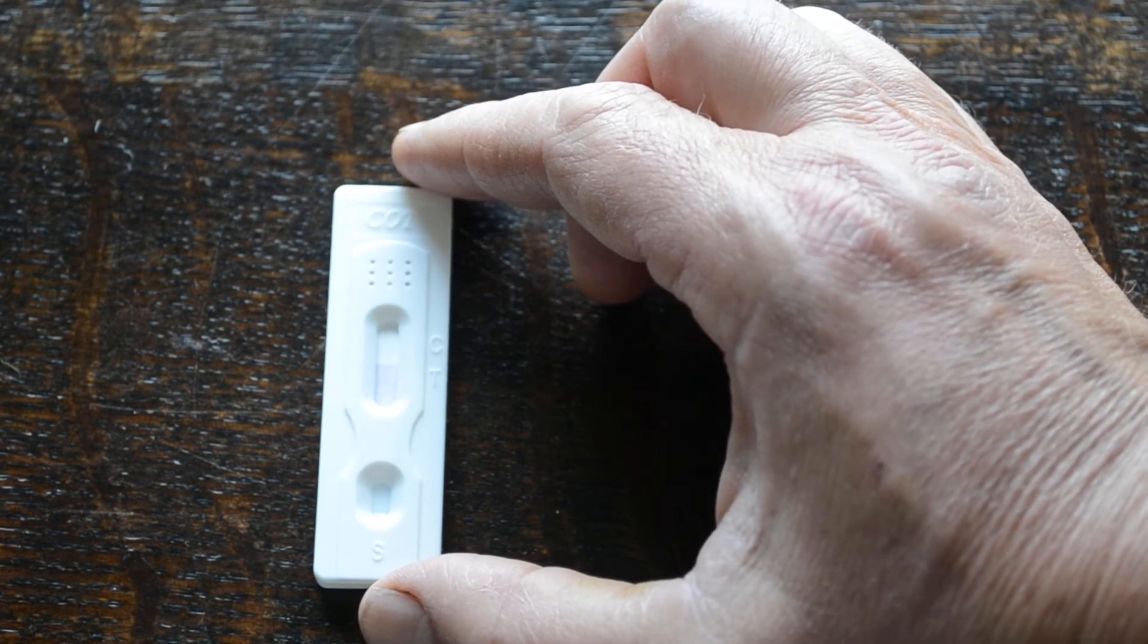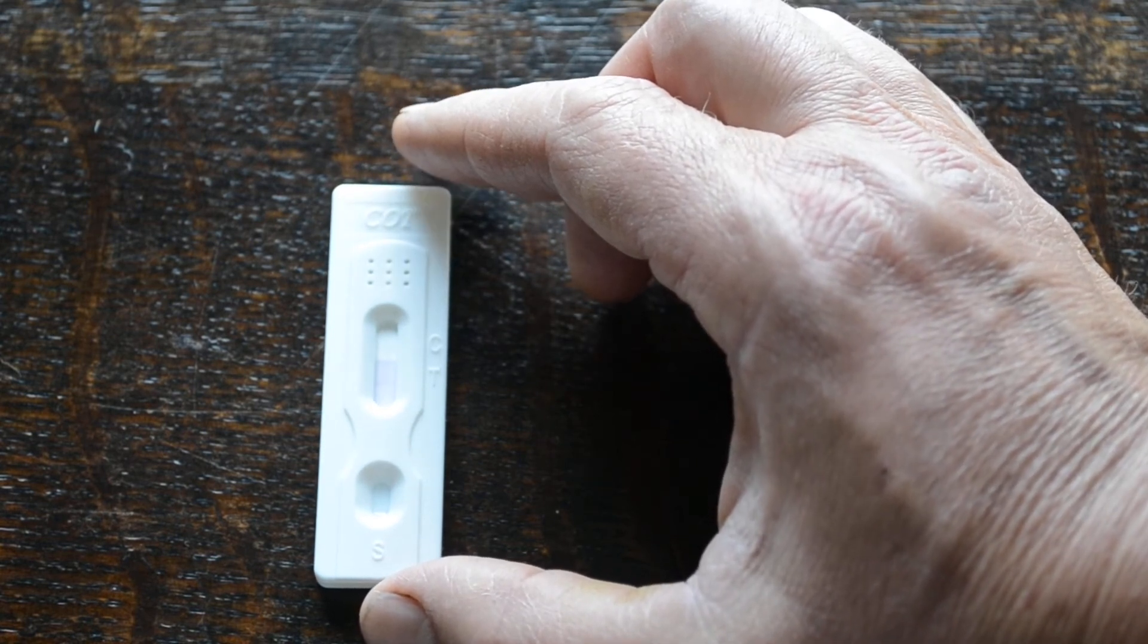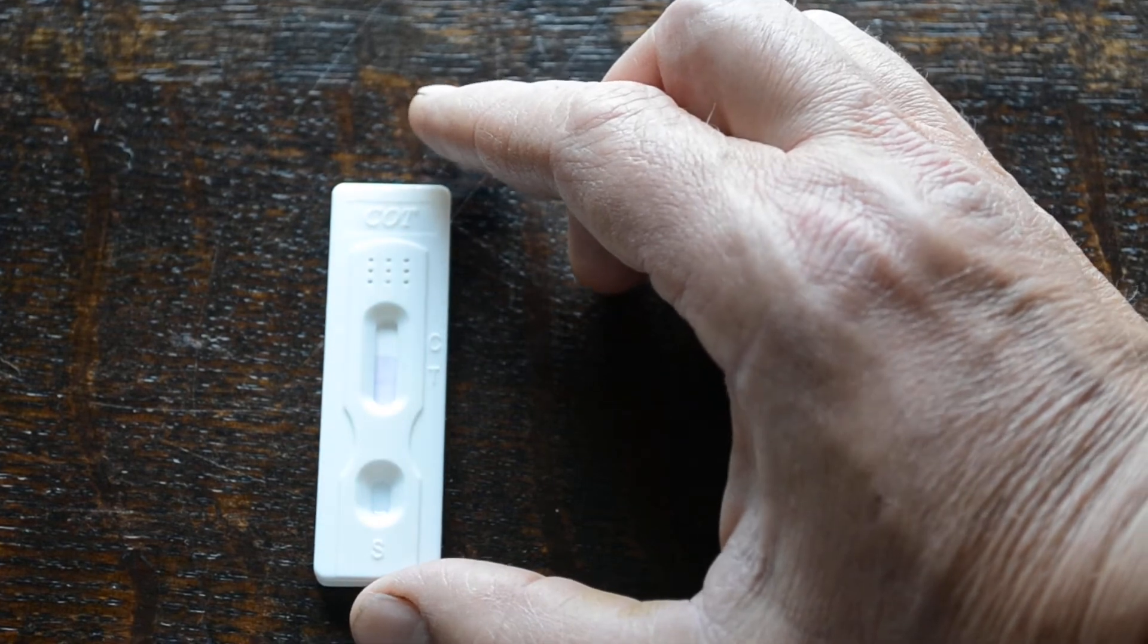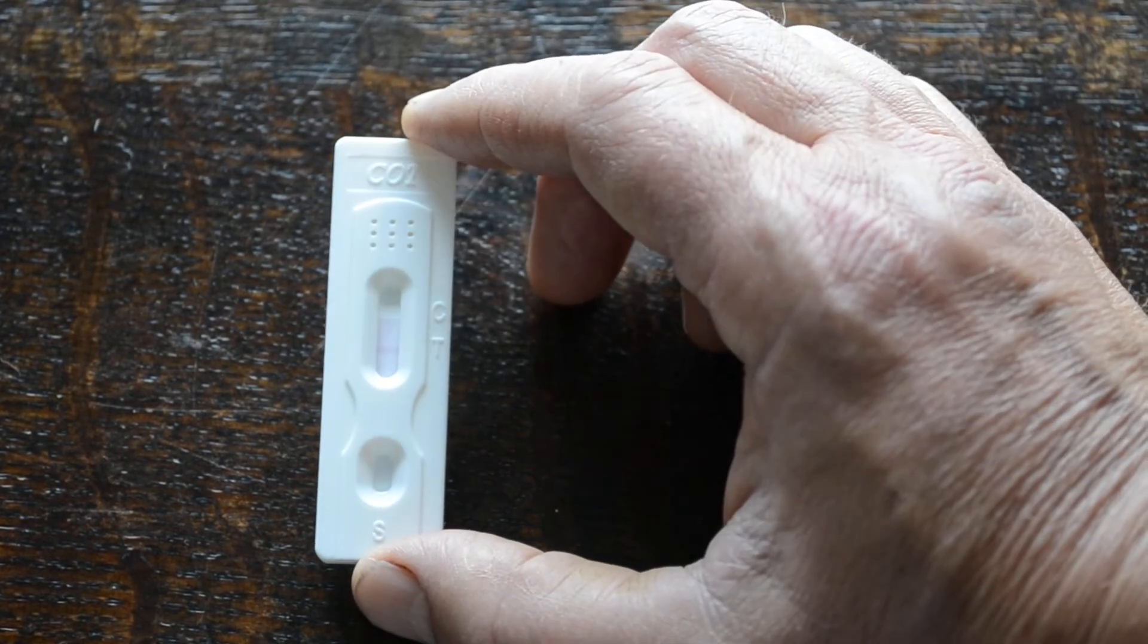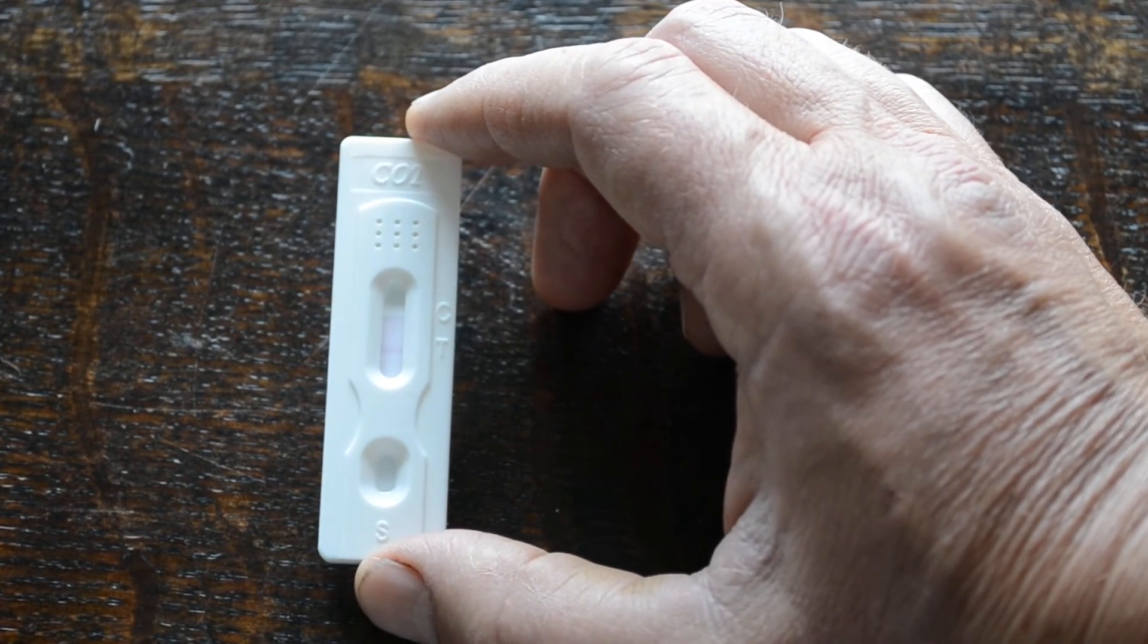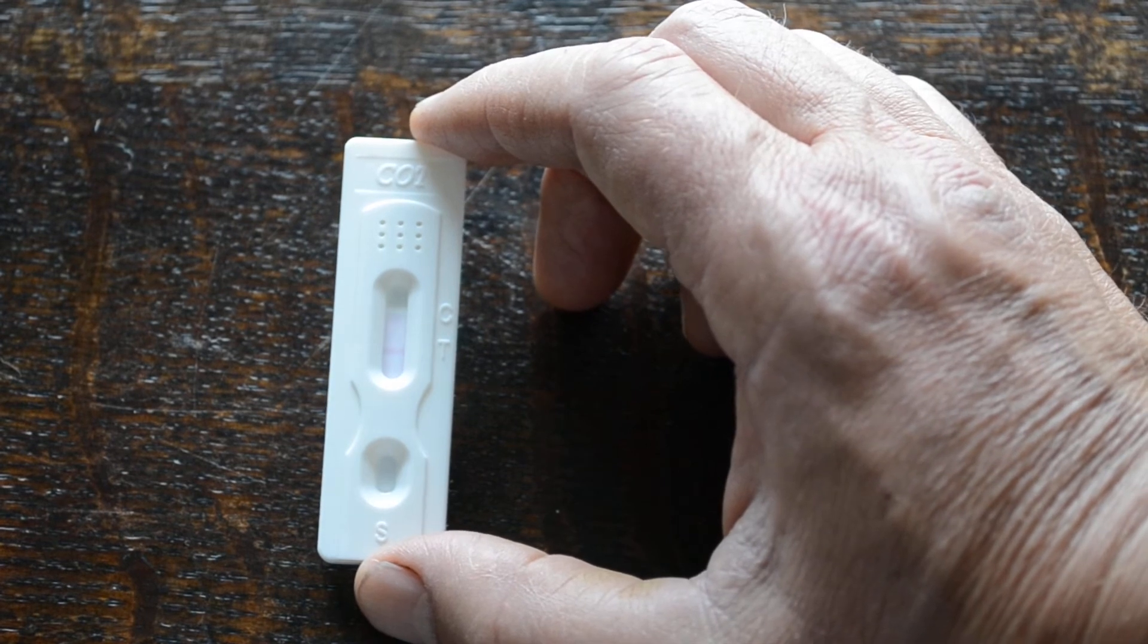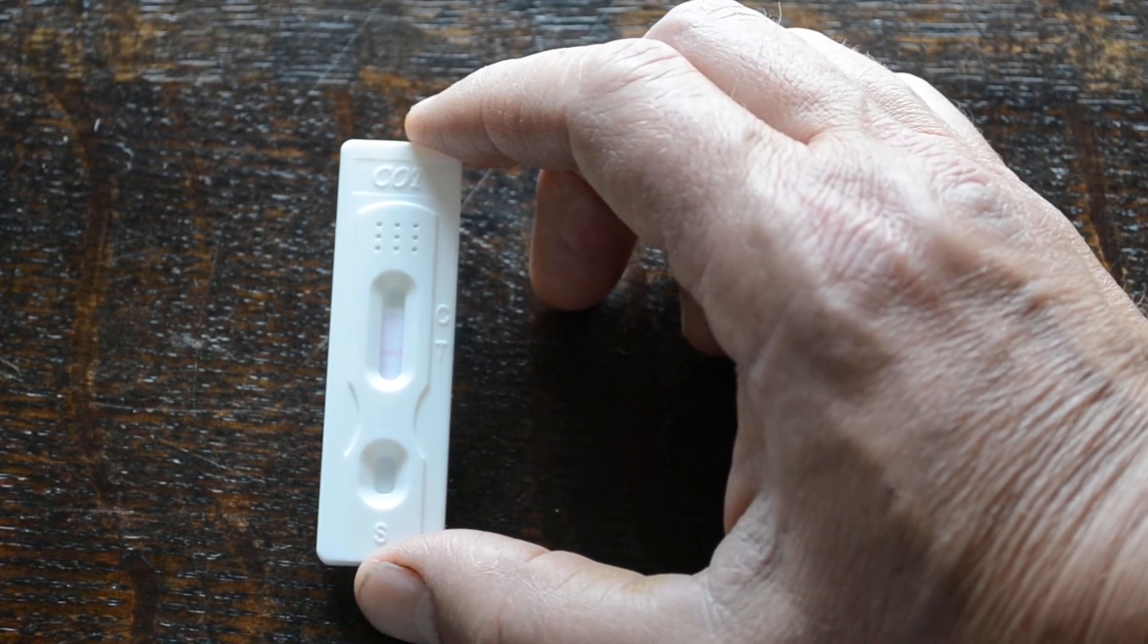You're looking for the presence of a control line and then the presence or absence of a test line. This is negative binding technology, as with all drug screens. So if there is no drug in the sample, the dye binds at the test line and gets a test line and a control line.